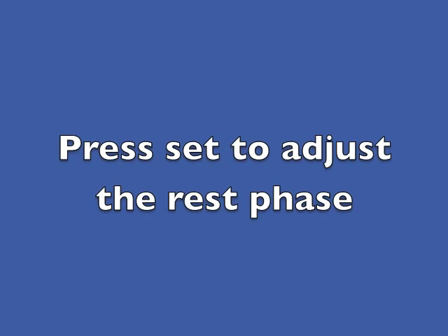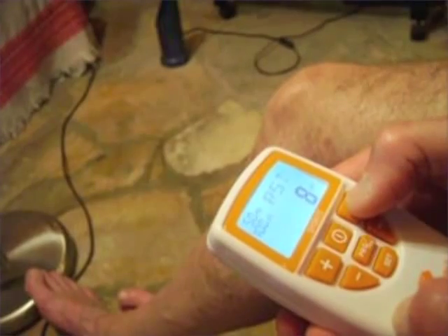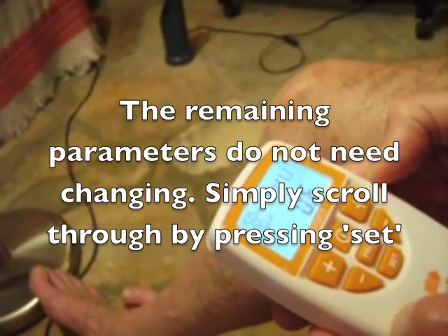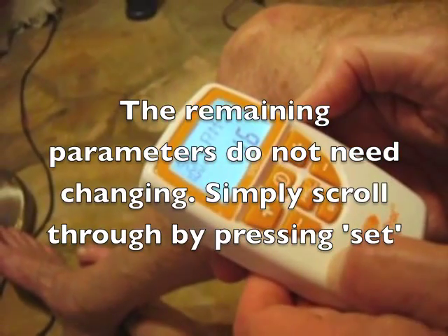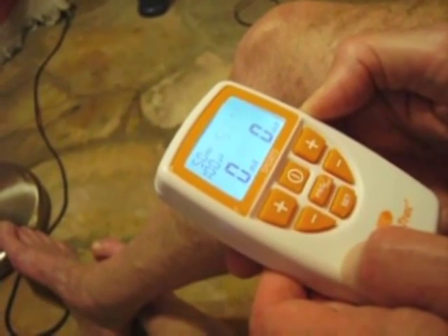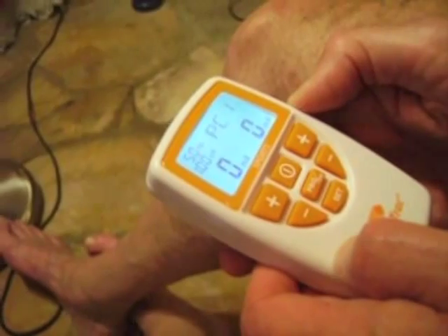Press set again. Next comes the rest phase, and it's very important that this should be longer than the work phase. I normally set it to 12 seconds so that it's three times as long as the work phase. Adjust the rest phase using the plus or minus keys on the right side of the machine. The remaining settings don't need to be adjusted — simply scroll through by pressing set until the screen shows 0 in the lower part, PC1 in the upper right, and 50 in the upper left. Then press escape to finish programming.